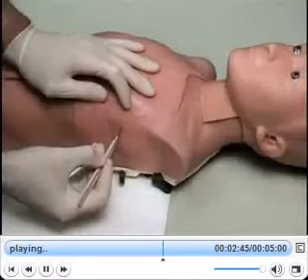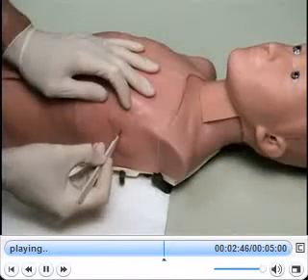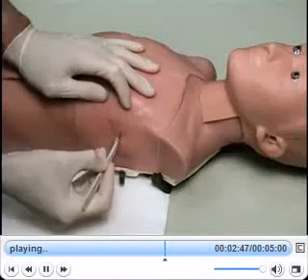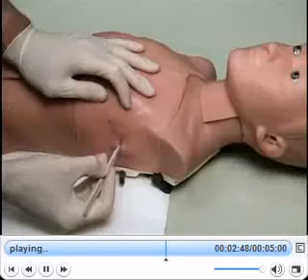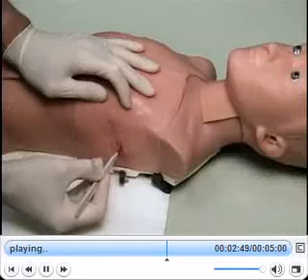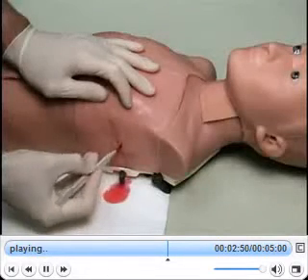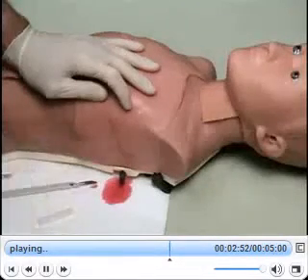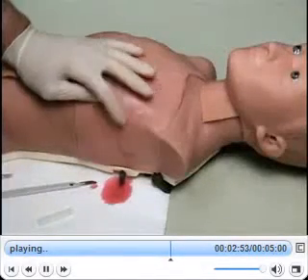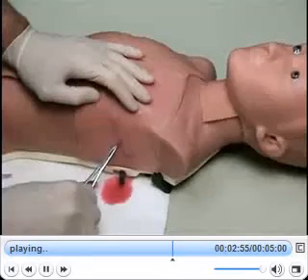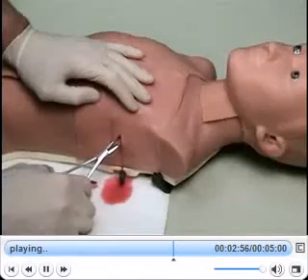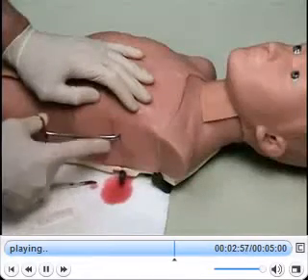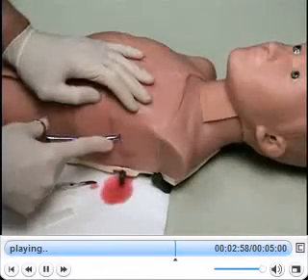The next procedure is the thoracostomy. Trauma Child is designed for chest tube insertion into the fourth and fifth intercostal space on both sides of the torso, allowing four students to complete the procedure on each tissue.